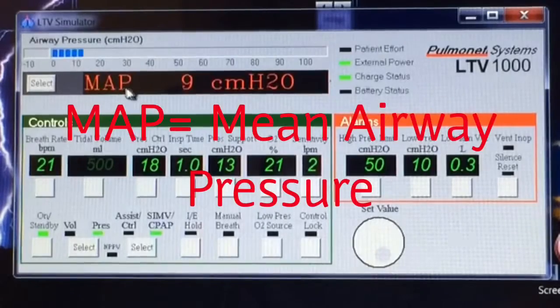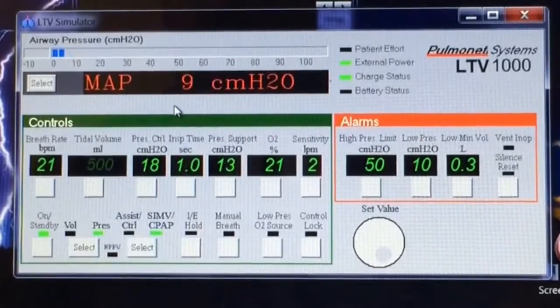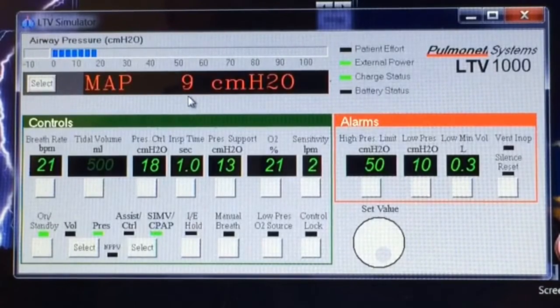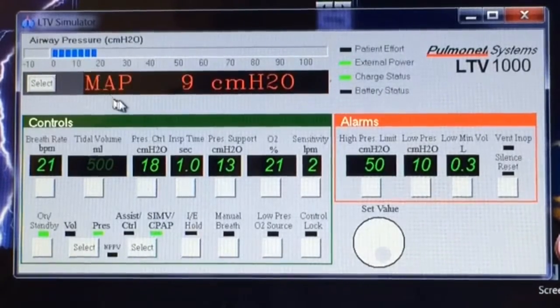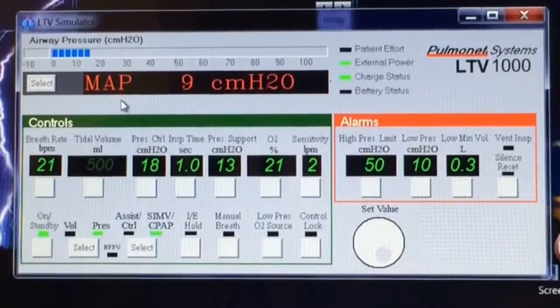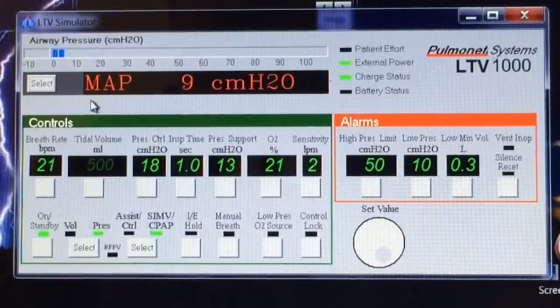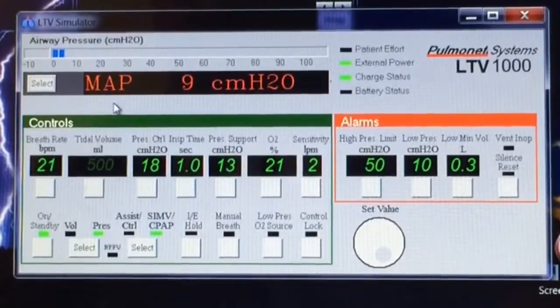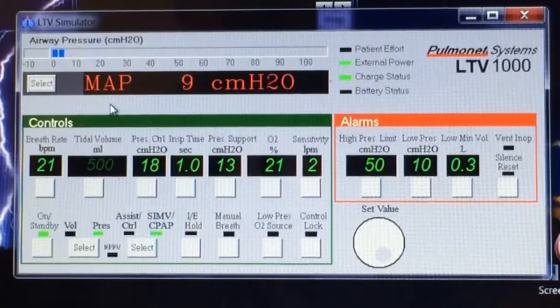The MAP is the mean airway pressure — that's the average pressure on their lungs over the previous minute. This is usually used for neonates and infants to make sure the pressure on their lungs is not too high. It gives us an idea if there's going to be any damage to their lungs, so we want to keep that pretty low, typically below 12, but the doctor usually deals with that. A good point of reference is to look at what their MAP has been, and if it's high, then there's a problem.